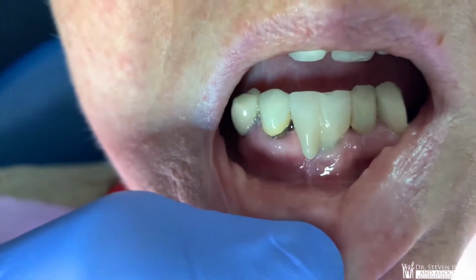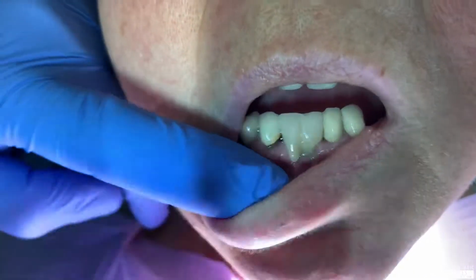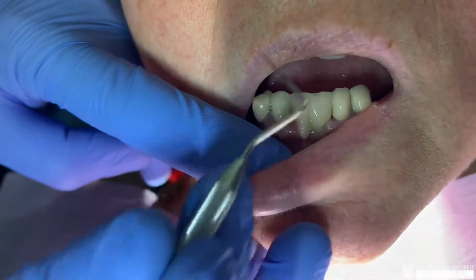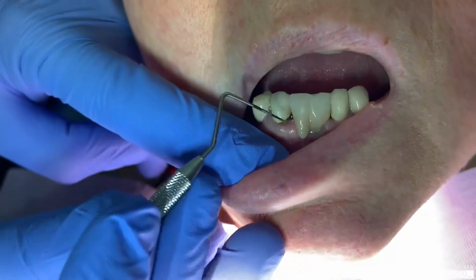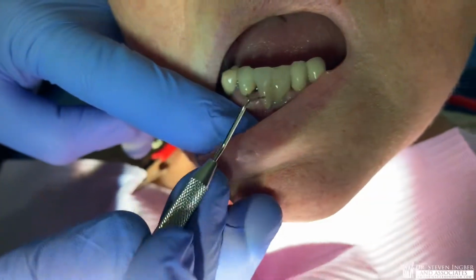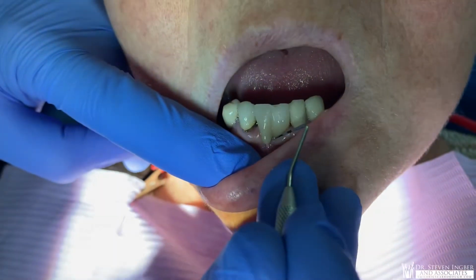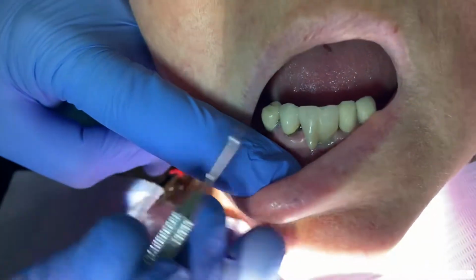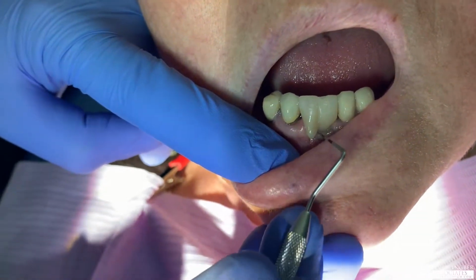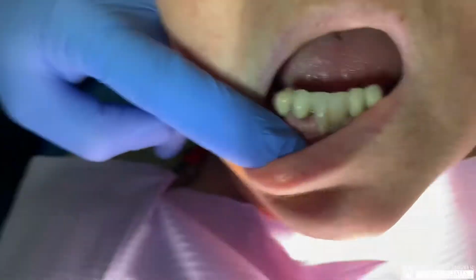Okay? Now this looks really freaky, but we're going to fix this because when we took out the tooth, the lab had to guess where to put the Pontic. It's actually not a great guess, but we're going to fix this up a little bit later. We're going to let this area heal up some more. We're going to take this off and do a gum graft in this area, but that's for another day.